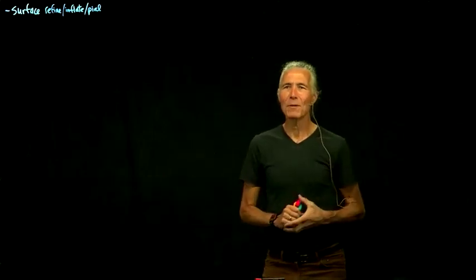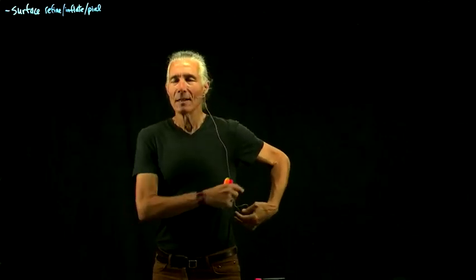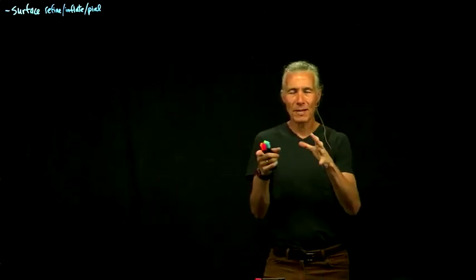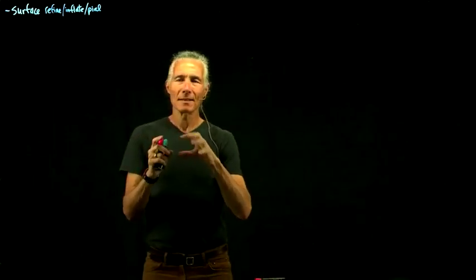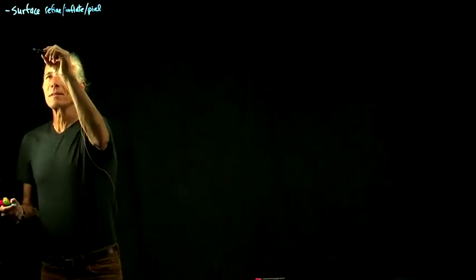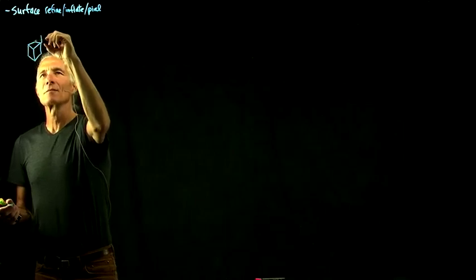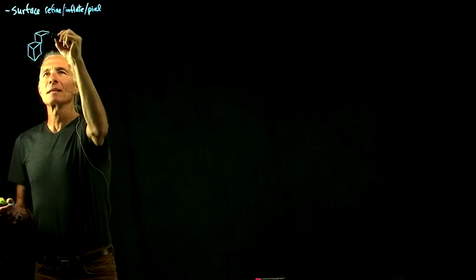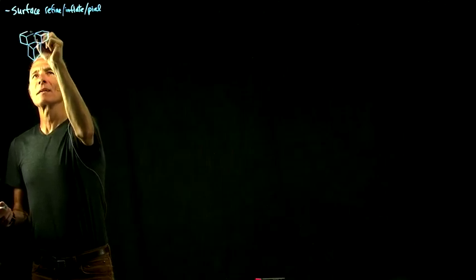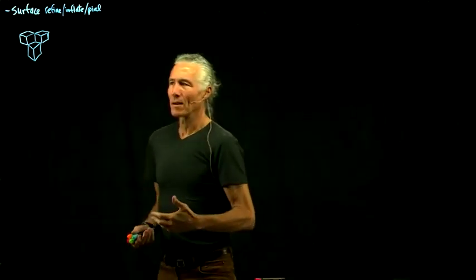So last time I was talking about how we make a surface. You start with a bunch of voxels, just 3D voxels, and then you decide where the boundary between gray matter and white matter is. The idea is you've got this huge pile of cubes, and then you say that these guys are classified as white matter, and the ones outside of them are not.